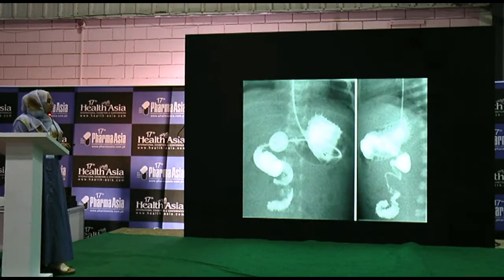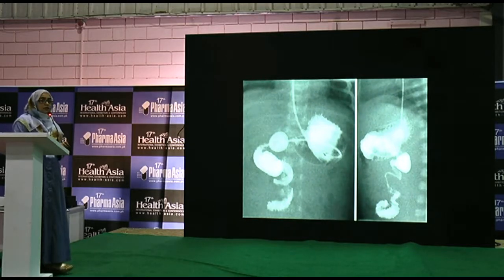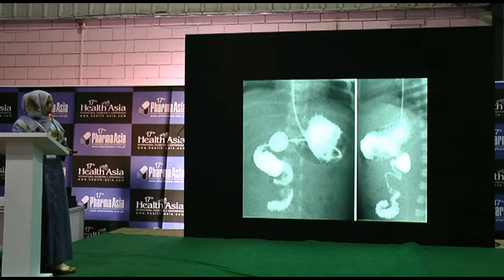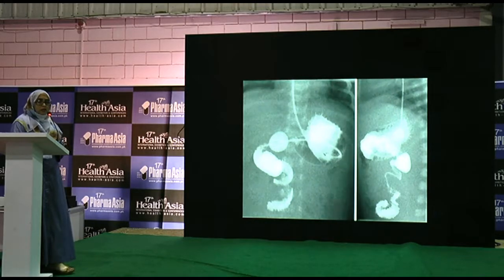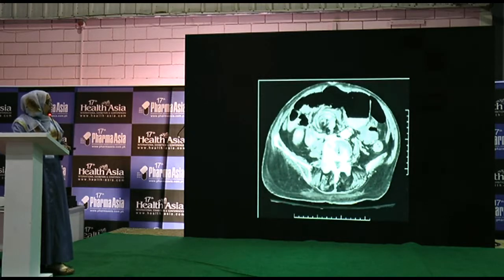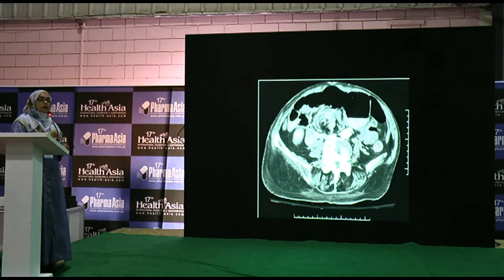This is a case of midgut volvulus showing the typical corkscrew appearance, due to spiral twisting of the proximal duodenum and proximal jejunal loops. This is an emergency requiring immediate surgery; otherwise the bowel will become gangrenous. This is a pediatric case, but similar findings in an adult show a whirlpool appearance of the mesentery — also a case of midgut volvulus in an adult.